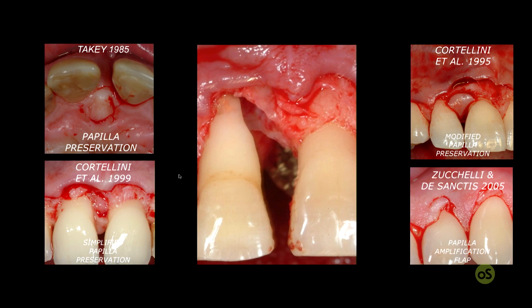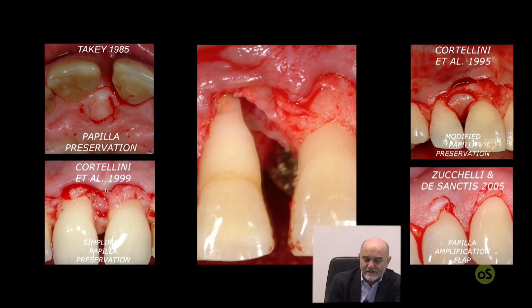Or, once there is no bone at the buccal or palatal aspect, you can split your supracrestal soft tissue in two. You will see this in more detail, with one split-thickness papilla at the buccal aspect, which is elevated in the buccal flap, and the whole suprabony connective tissue is turned and elevated full thickness with the palatal flap.